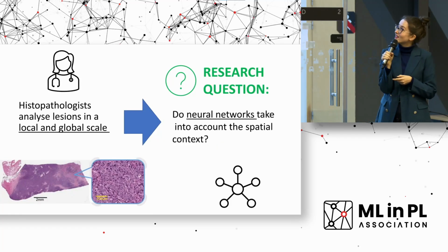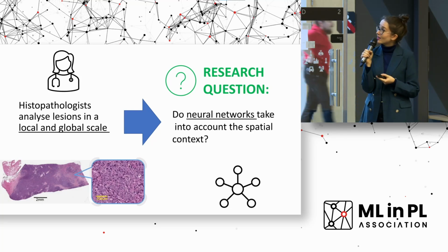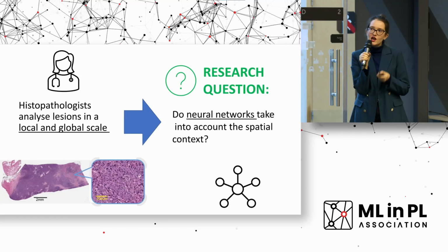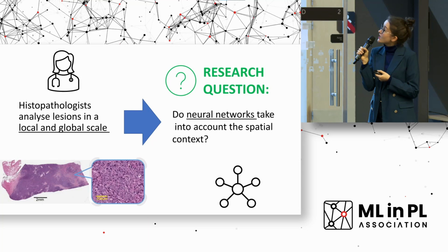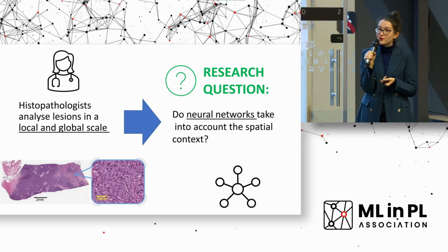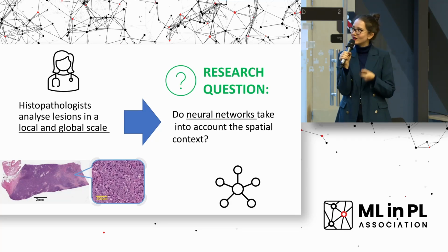Our idea, after some discussions with histopathologists, is that maybe we should analyze the model even further from a slightly different aspect. What we have learned from the experts is that they analyze lesions in both global and local aspects.